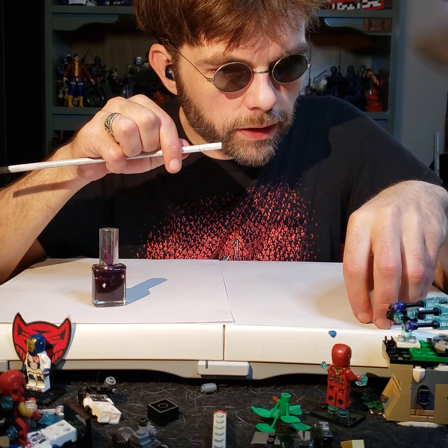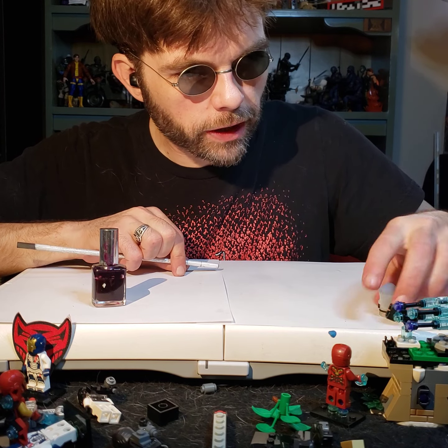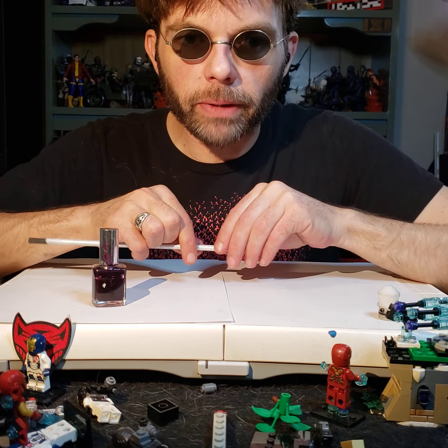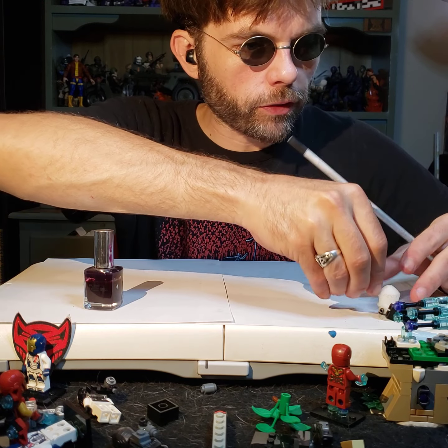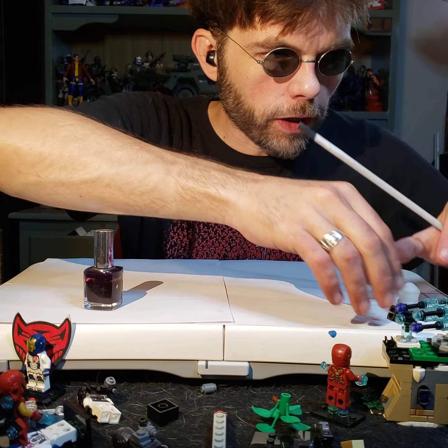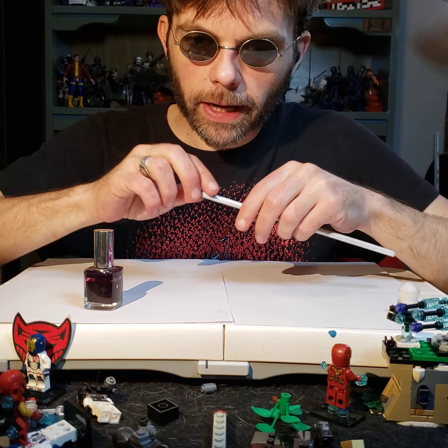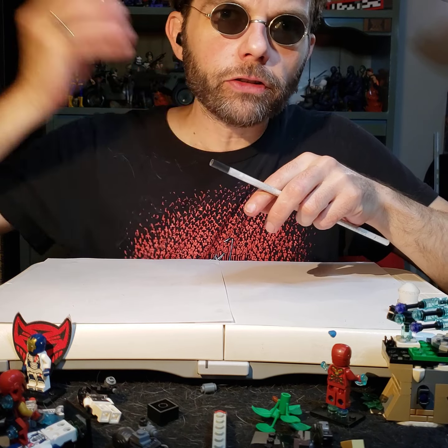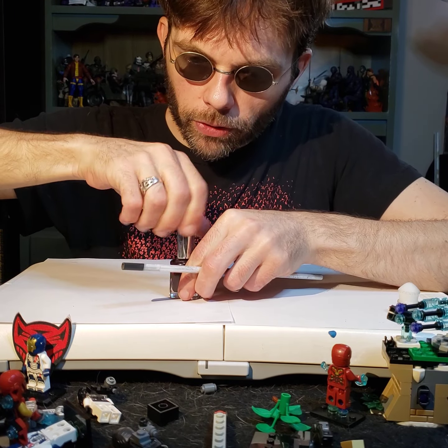Now we're going to set this on over here up at the side. Now, before I did the video, I set up paper down here because I don't want to make a mess. Now, we're done with the Allen wrench. We're going to set it over here next to the cane tip, just so we don't lose either of those tools. Now that we've got that, let's pull out our nail polish. Let's give it a shake. And then we're going to pull it out. And we're going to paint the end.